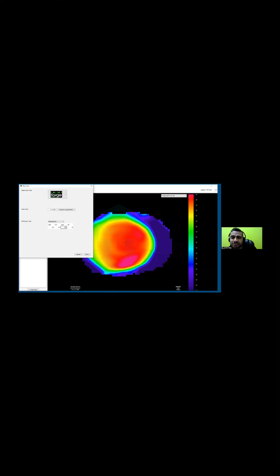This is a particular software design where you'll select that you want an Ortho-k design. The topography is already uploaded. You'll put in the HVID and then a spectacle refraction. And then once you put that in, it'll populate an initial tear film analysis of a design that it just created based on an algorithm. Now, you might look at this and say, well, it looks good, but maybe it needs some modification. So it's very rare that you'll just have it populate a design and you're not making any changes.